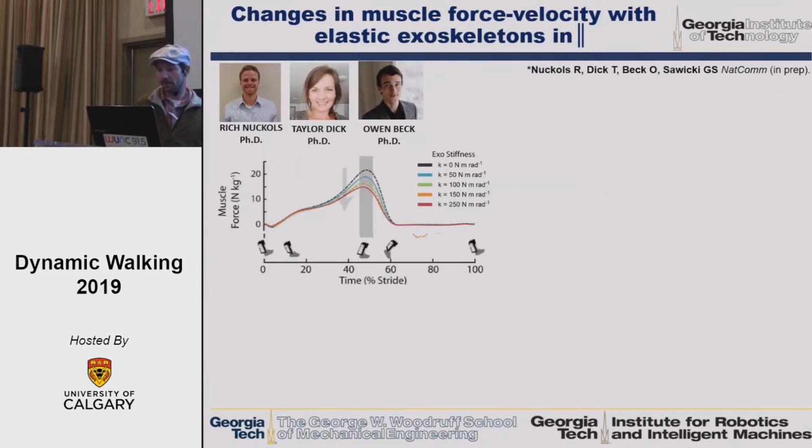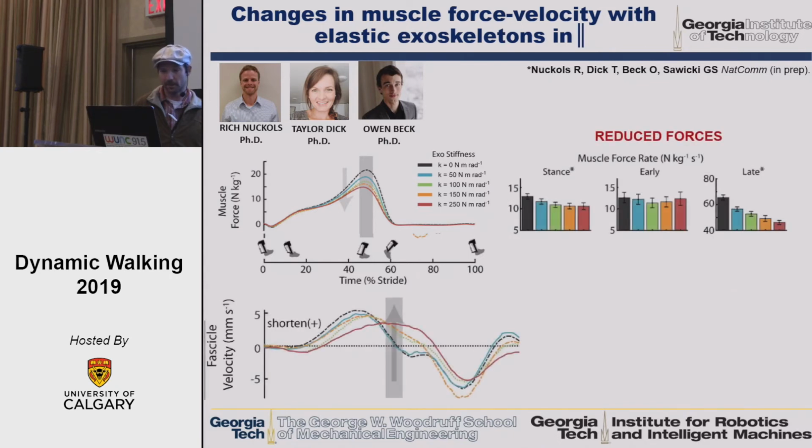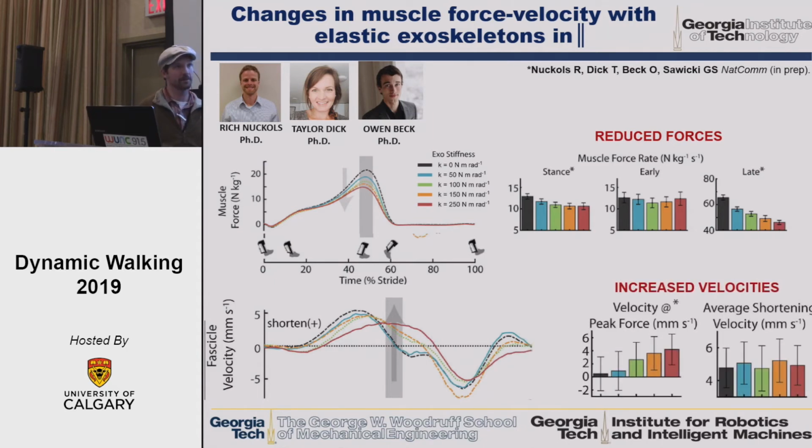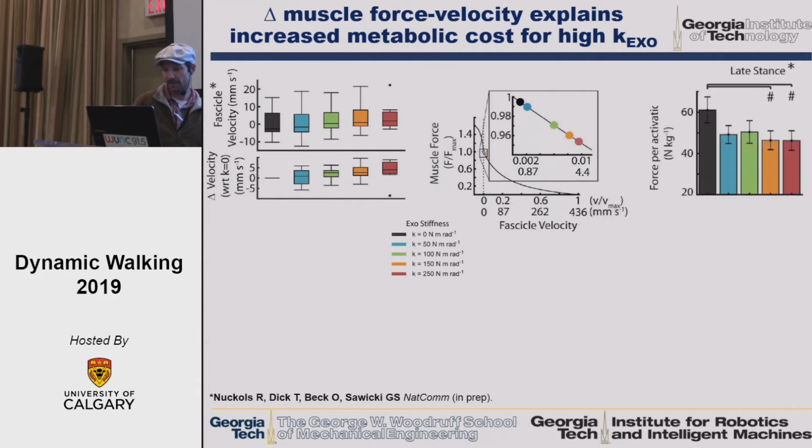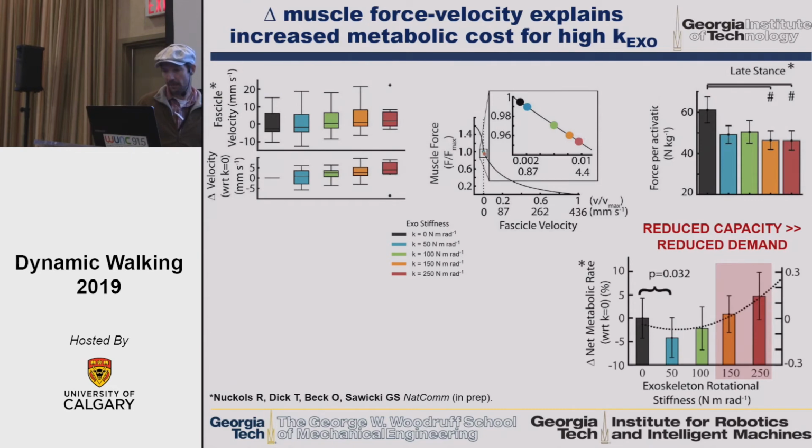If you think about the force-velocity relationship, another interesting thing happens. So here again, forces go down. If you measure velocity of the soleus muscle, it increases. So you make muscles longer, they have to shorten faster at the end of the cycle to get back to the same spot. And that's not a good thing for force capacity. So especially for the stiffest exoskeletons, we found a reduced force per unit activation. So force demand is still going down, but the force capacity is poorer. And that, we think, partly explains the upturn in the metabolic rate, whole body metabolic rate at high stiffness.